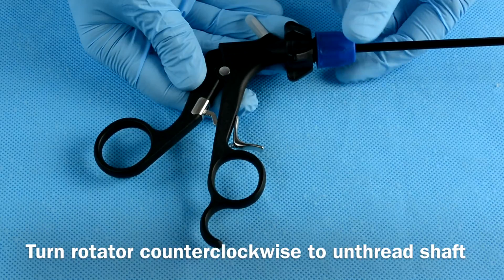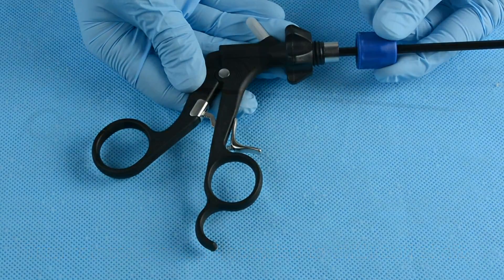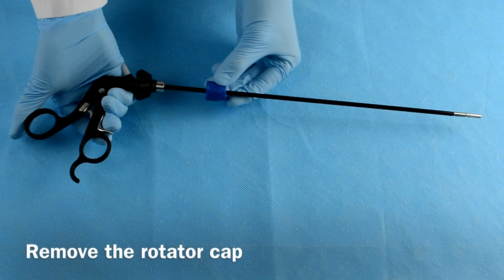To disassemble, hold the rotator and turn it counterclockwise to unthread the shaft. Then remove the rotator cap.